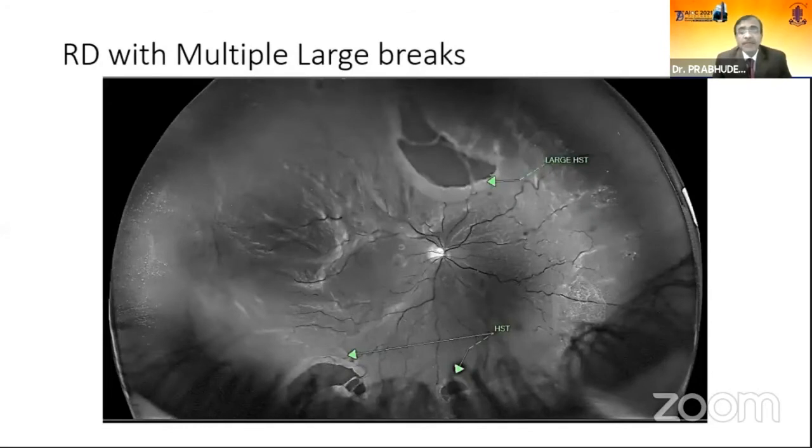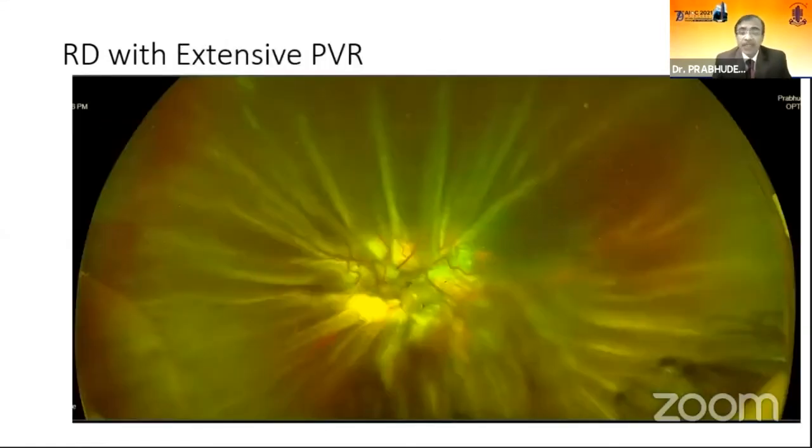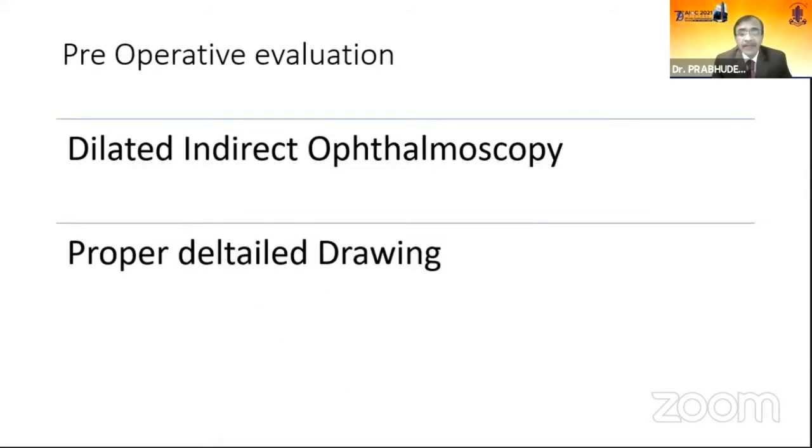However, if the patient has multiple breaks at the margins, I would not tend to consider a scleral buckle. And if there is definite PVR more than C2, no question of considering scleral buckle, and obviously in extreme PVR, there is again no doubt that we should consider other possible surgeries. Here again, a giant dialysis following a cataract surgery, we avoid doing scleral buckle first. As Omar had rightly pointed out for pneumatic retinopexy, the same applies for scleral buckle.